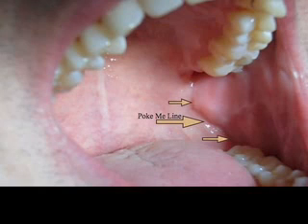Note the pterygomandibular raphe is that portion of soft tissue distal to the terminal molar. The raphe is a landmark only. Needle penetration is not accomplished in this area. There is a very distinct line on the lateral aspect of this raphe. This line does denote the location point for the needle tip to penetrate soft tissue, and therefore I have termed this area the poke me line.